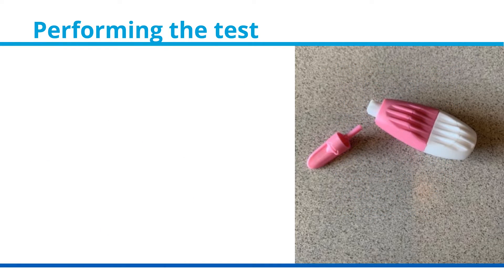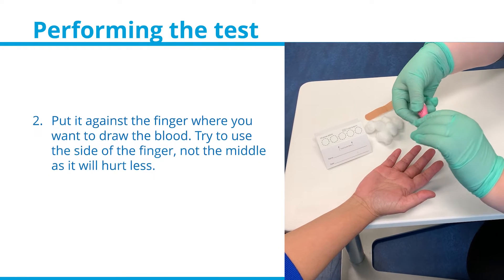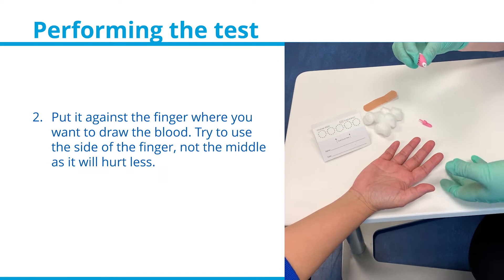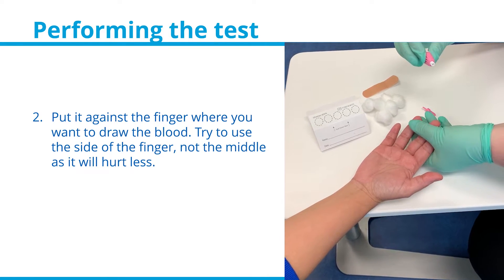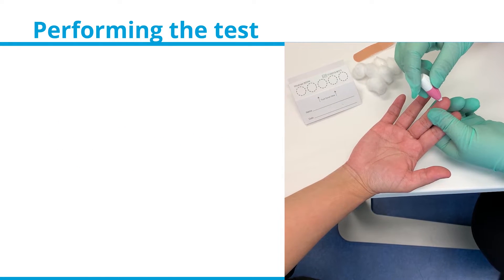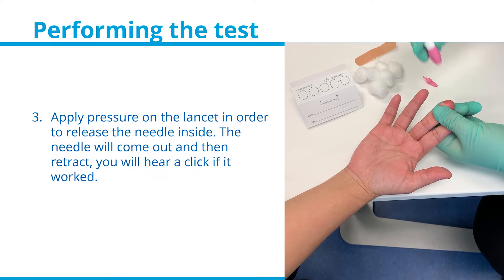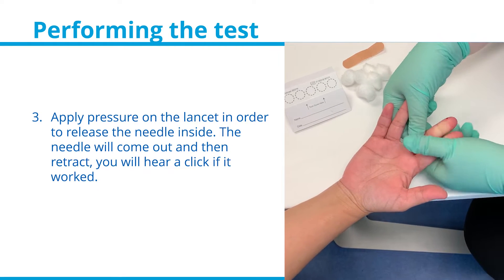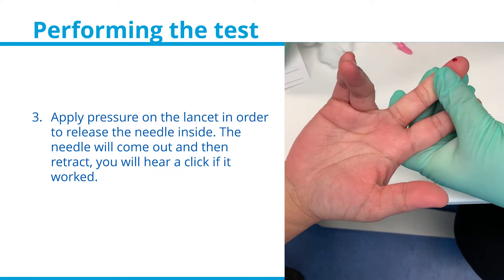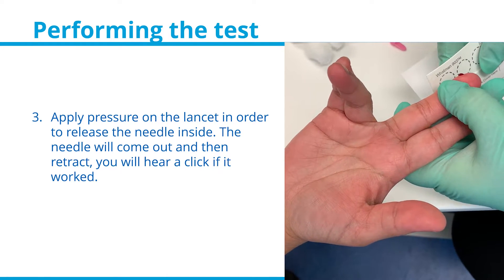Performing the test. Remove the small end of the lancet and place it against the finger where you want to draw the blood. Try to use the side of the finger and not the middle, as it will hurt less. Apply pressure on the lancet to release the needle inside. The needle will come out and then retract — you will hear a click if it worked.